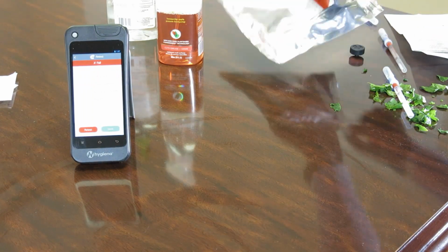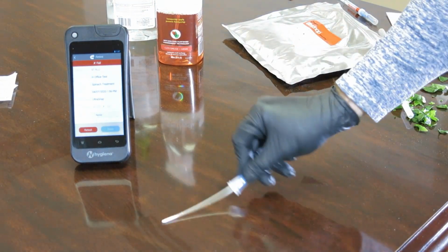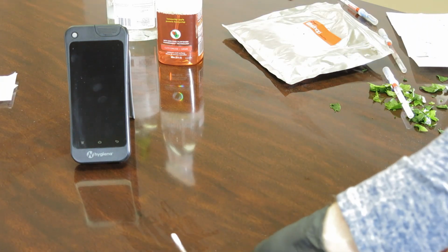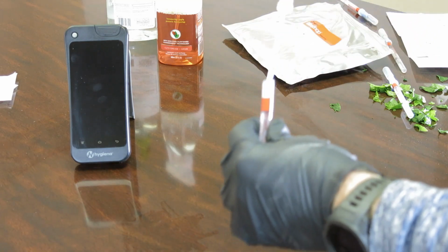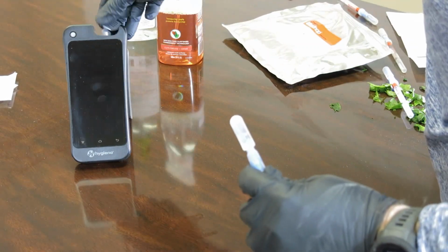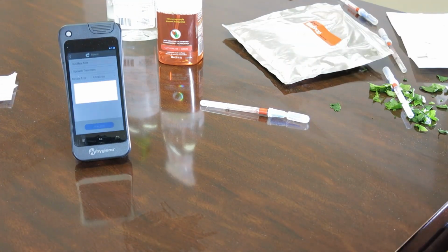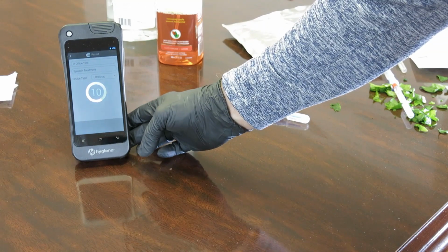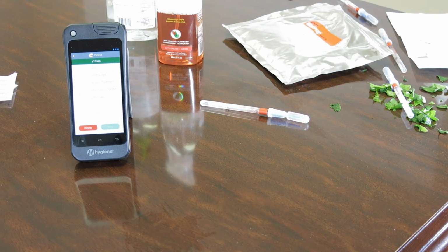And once again. Back in here. Snap that, squeeze it, spin it. Retest. Oh, we get a pass of 14 units. Nice going. Demonstration of principle.